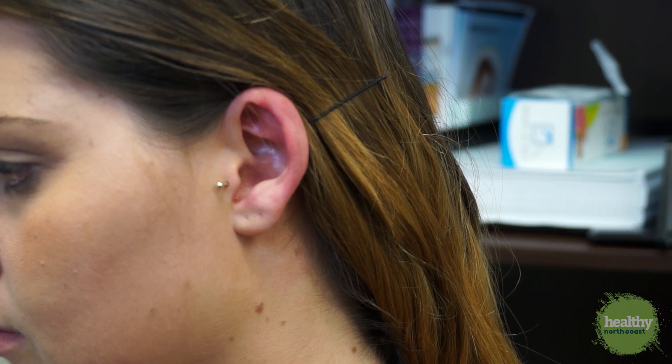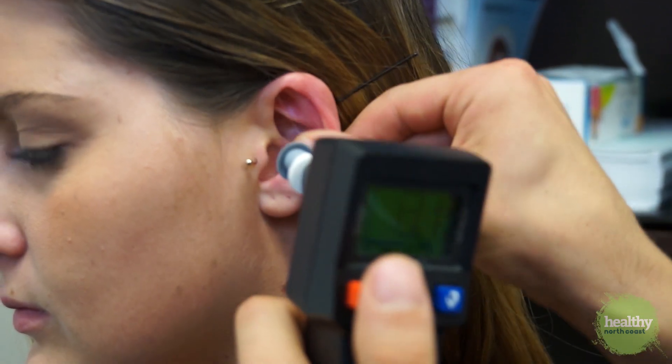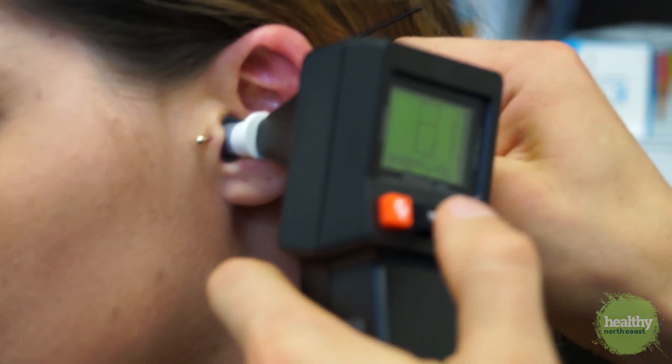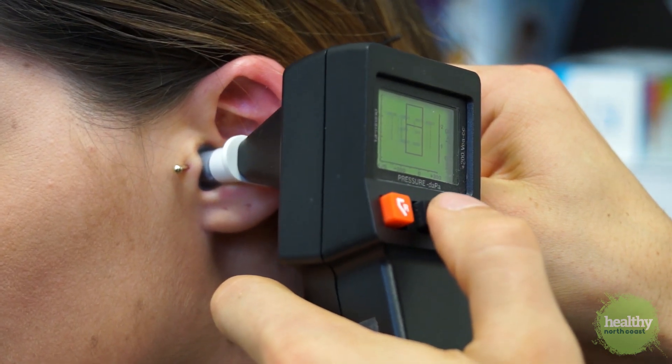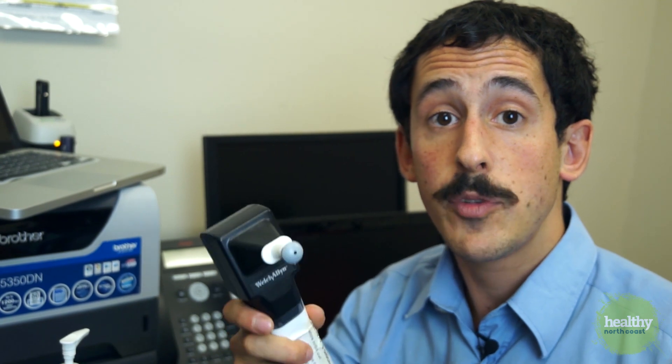To use the tympanometer you have to take a measurement of both ears, even if you think one of the ears is healthy. First press L, then press Test. Next check the right ear. When you've got a good measurement from both ears, place the tympanometer back in its stand — a report will print out and tell you just how mobile or immobile the drum is. Remember that it's common for the tympanometer to say 'leak' once or twice while you adjust the position, but if it keeps saying 'leak' you've probably picked a tip that's too small — size up and try again.